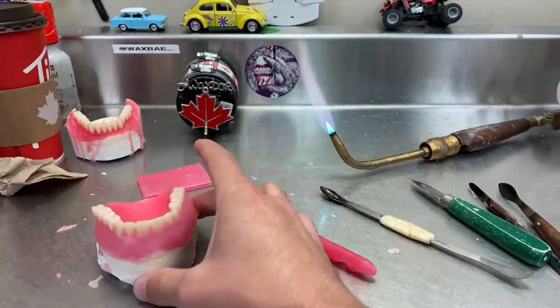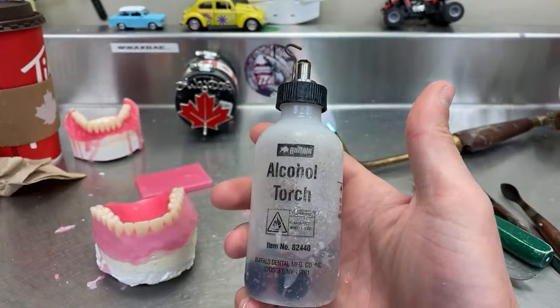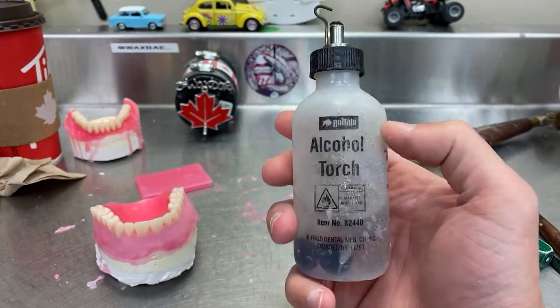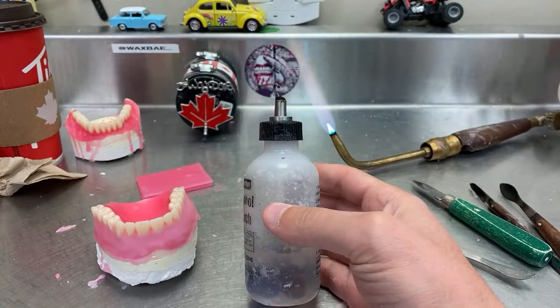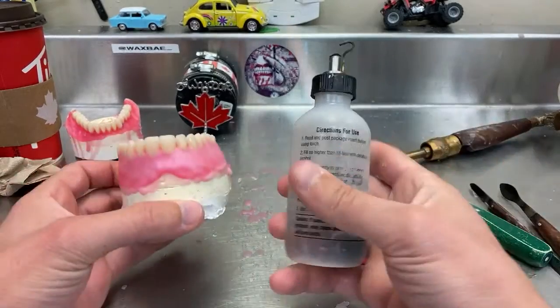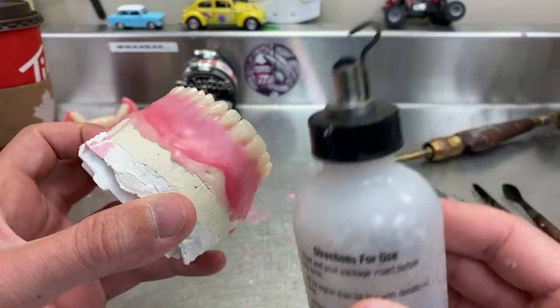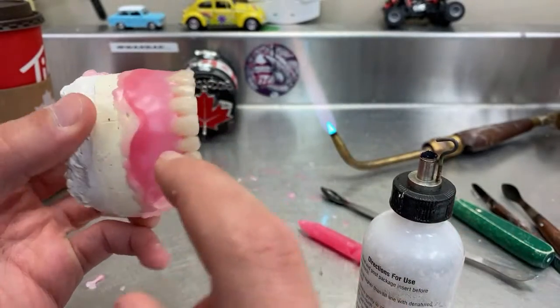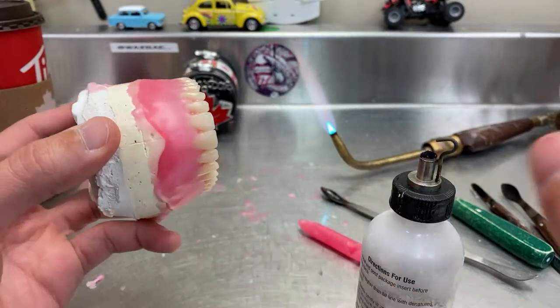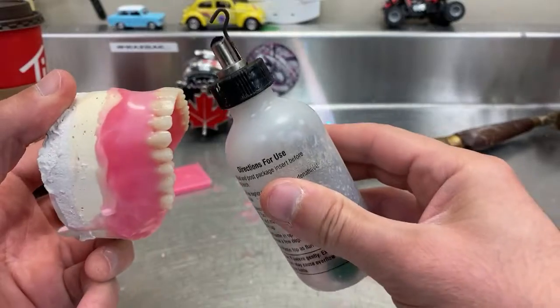And I'll show you another trick soon, which is trying to flow the wax. Do I need to explain what this is? Because I feel like in every live and every video I post, people will ask, what is this? But anyway. So you see here, there's a little bit needed in that area here. So what I'm gonna do, trying to make the wax kind of from the top, flow into it.